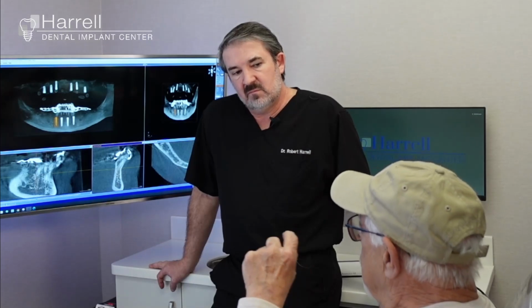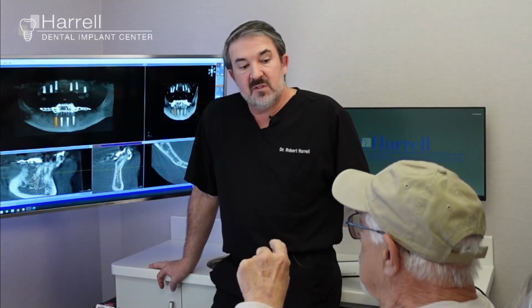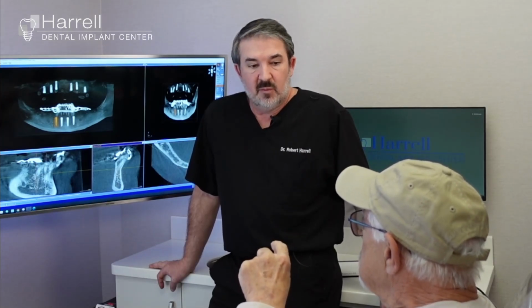Now this first set is a temporary set. The first set that you receive is a temporary set, and that is a set that we will manufacture here. They're typically 3D printed. They're made from the designs that we've created during the planning phase, and they're already set to fit the implants prior to the surgery.